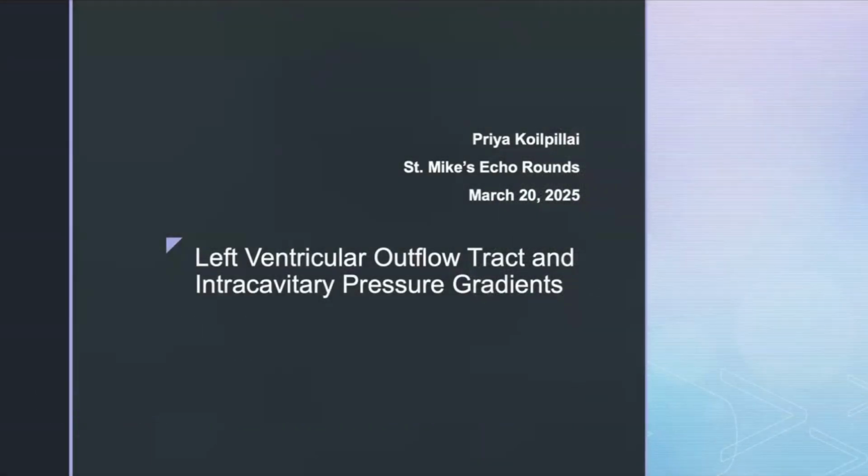So today's topic is on left ventricular outflow tract gradients and intracavitary pressure gradients. A reason I picked this topic is because it's something we see a lot of, but in terms of what we do, how we manage it, and when to measure it, I was a little uncertain, and I thought maybe if I was, some others were, so it would be an opportunity to learn.